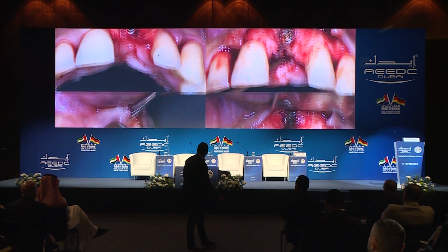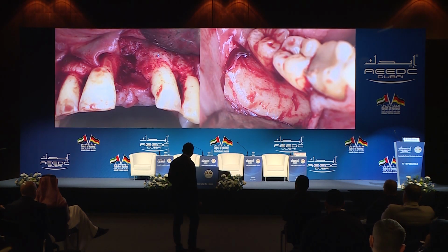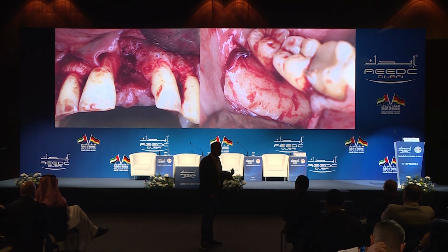And when you look at this, look at the angulation. This is crazy. This is not ethical today. This is malpractice, placing the implant in this position. So in these cases, unfortunately, we have to take these out.